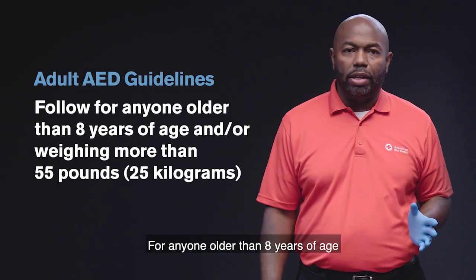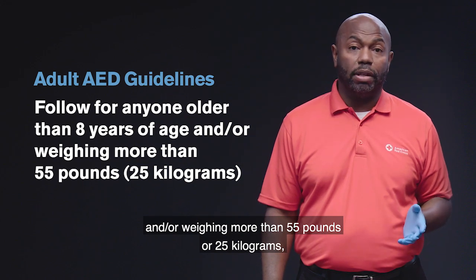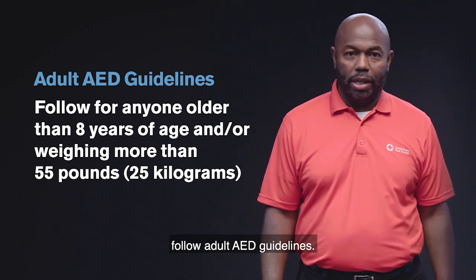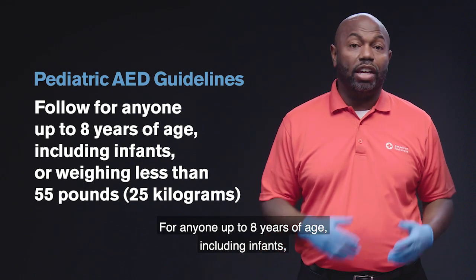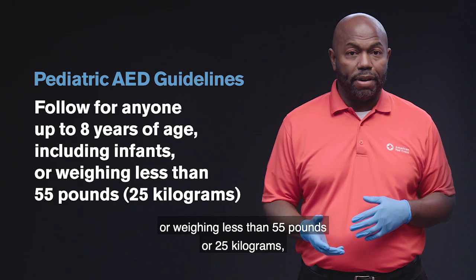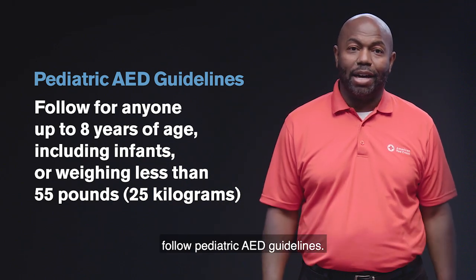For anyone older than eight years of age and or weighing more than 55 pounds or 25 kilograms, follow adult AED guidelines. For anyone up to eight years of age, including infants, or weighing less than 55 pounds or 25 kilograms, follow pediatric AED guidelines.